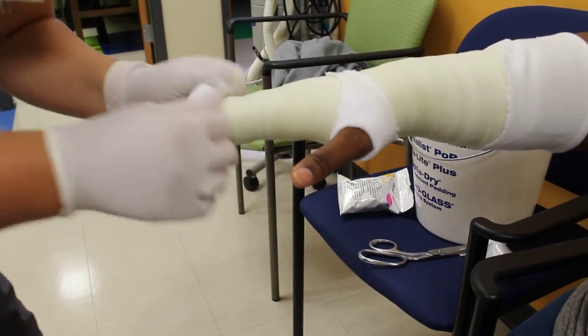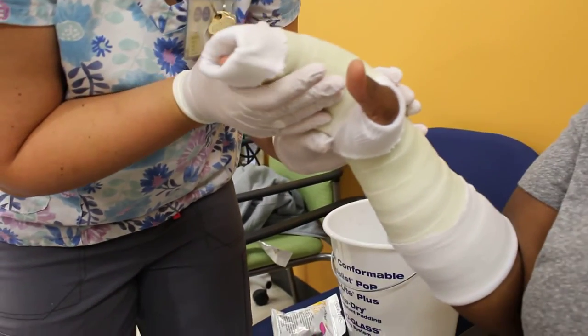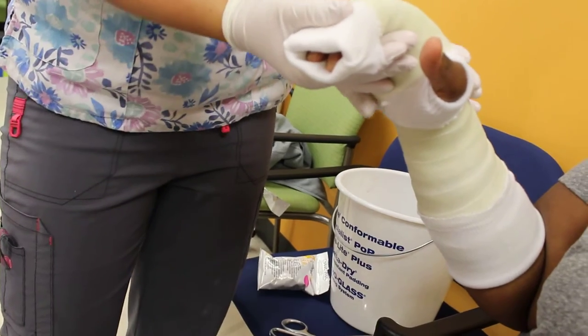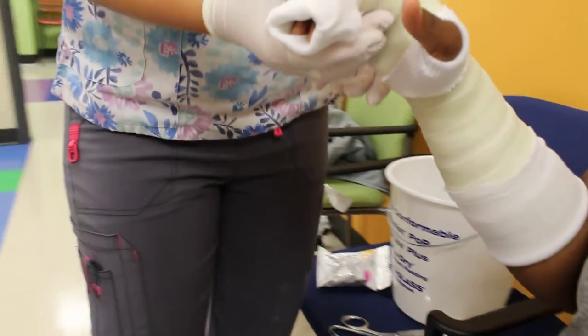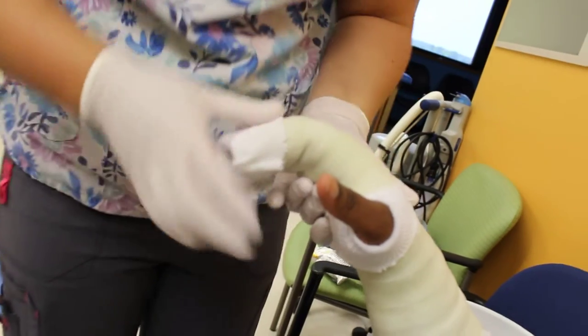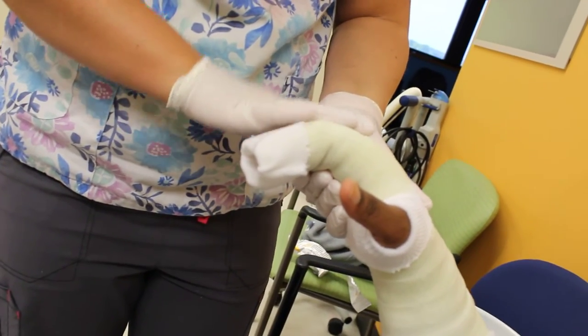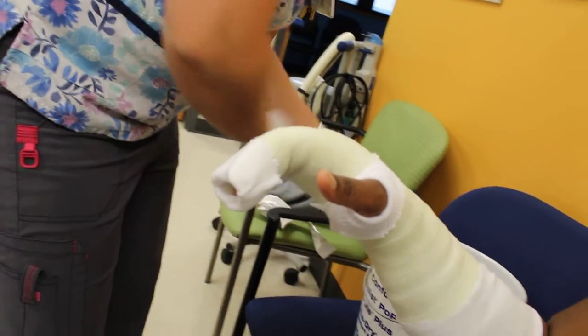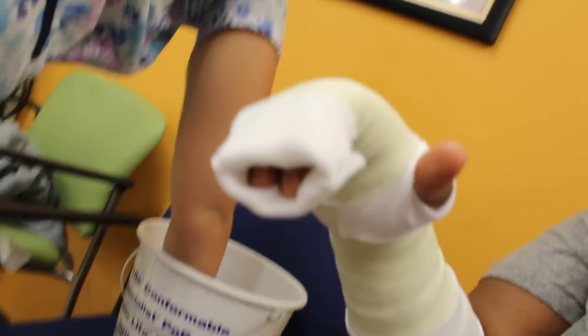We're going to fold it back — fold this back. Then when we come up, we're going to bend the fingers. If they won't stay in this position, you can hold it here until that white dries. But if they're good, you can go ahead and put the colored fiberglass on.